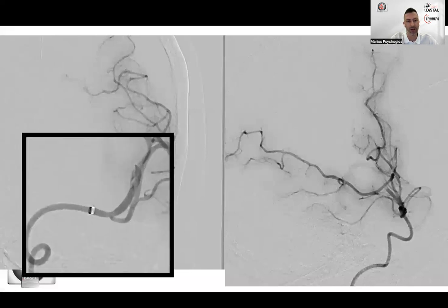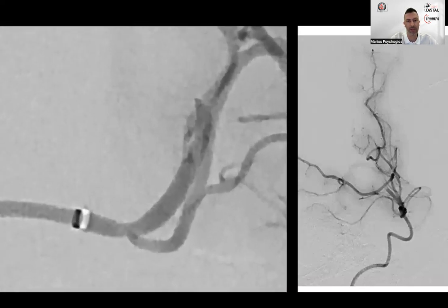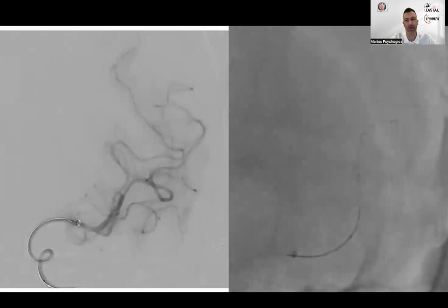So what would you do now? The next step for us is to go and navigate distally to the clot with a small microcatheter, and then place a smaller 3 millimeter stent retriever on the segment. And one thing that we will be discussing also for inferior occlusion, as you can see here, is that we place this stent retriever primarily distally to the clot.